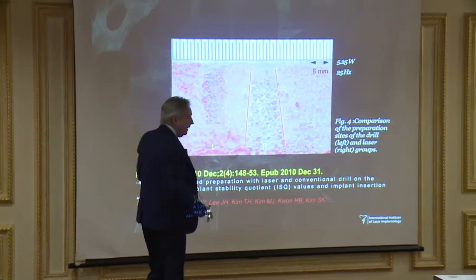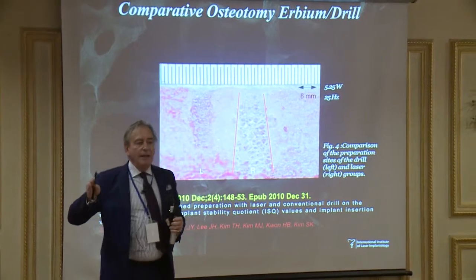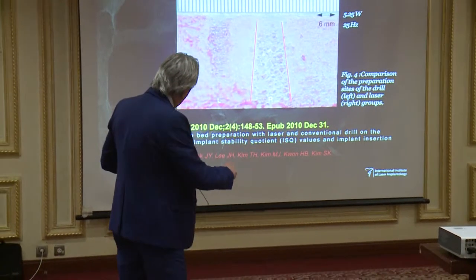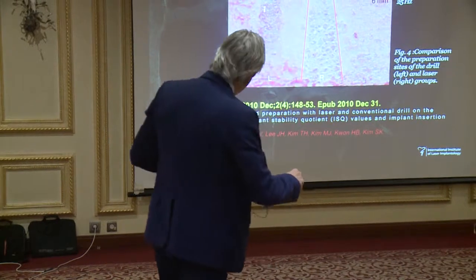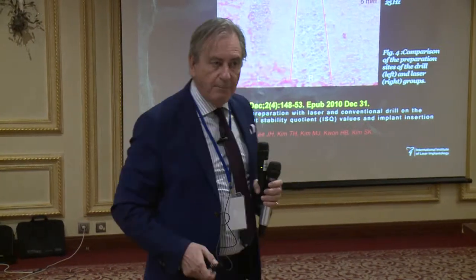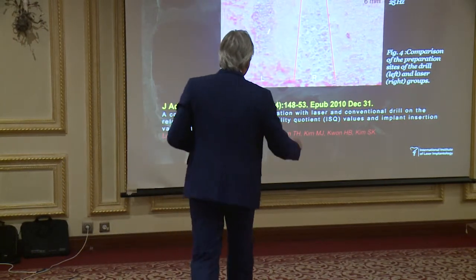Look at this. Probably this team were experts in placement of implants, for sure. But first of all, they were thinking of placing a cylindrical implant here. And this is the picture that I took from the publication. Look at that. What are you seeing here?